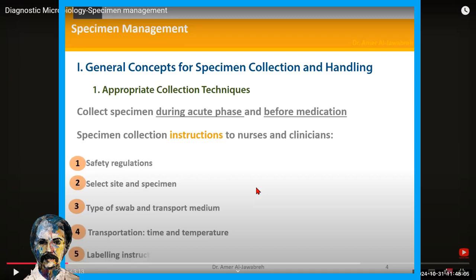Maybe he just threw your sample on the bench for 4 hours, 5 hours. You don't know this. Some people are not careful, and it becomes a habit to leave things on the bench for as long as they are left. This should not be your style of working. You should take care of the sample. Temperature, time, all of these affect your results.